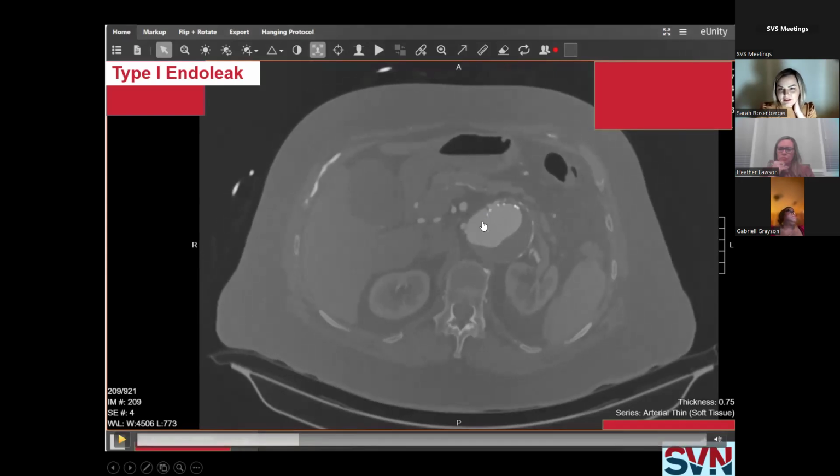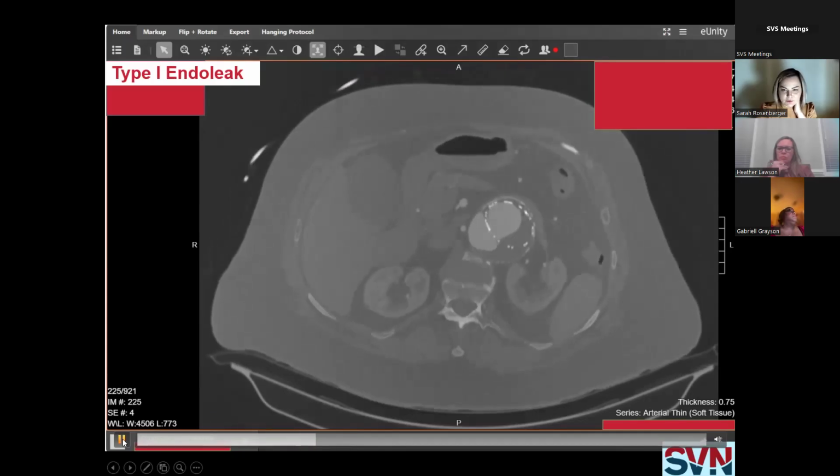And here you can see, maybe I let it run a second more. Here you can see our stent graft that was placed, and the aortic wall comes all the way out to here. So you have just as much high pressure flow going through the aortic graft stent as going into the aneurysm sac. This aneurysm sac is under the weight of the full arterial pressure. So this risk of rupture is based on full size, and having the endograft there provides you no protection.